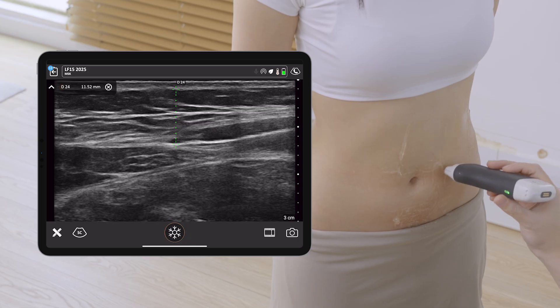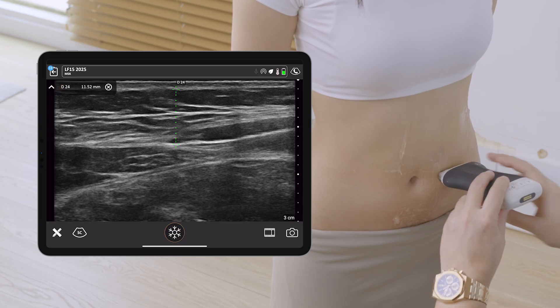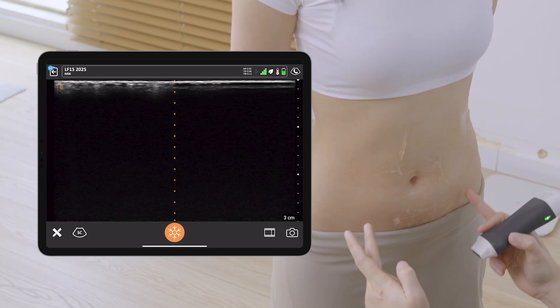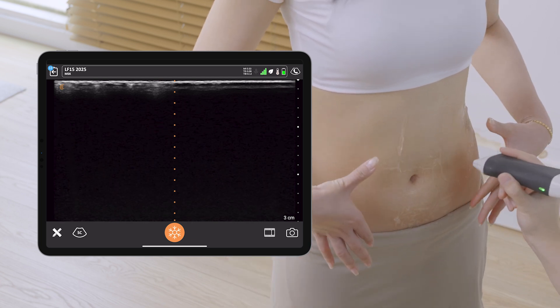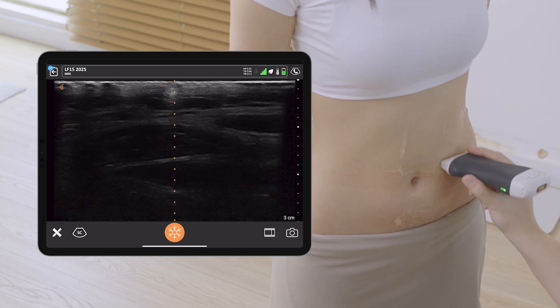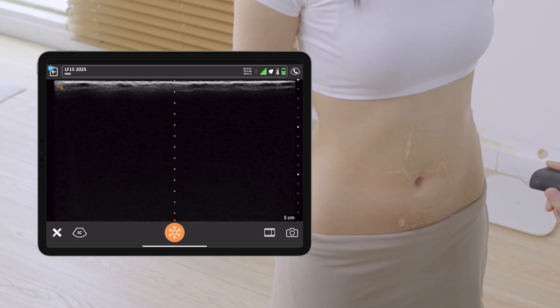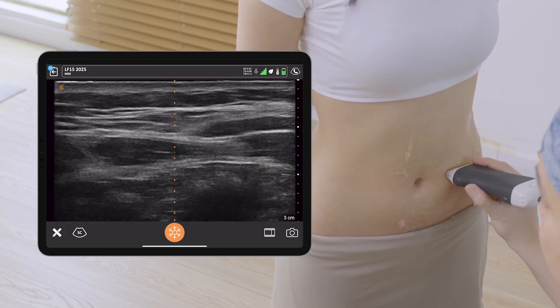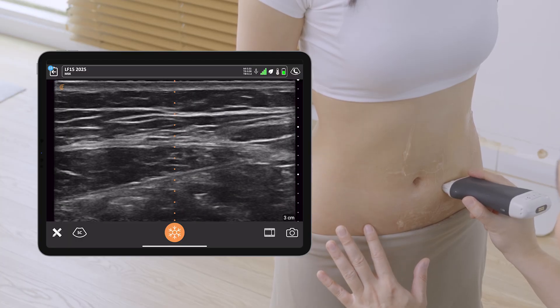I will ask the patient if she wants this line to extend downward or just limit it to the upper abdomen. This information is really useful in my surgical planning. She wants her linea semilunaris to extend all the way downward, so we call this in females a high definition liposuction, because we need to create the line all the way downwards.